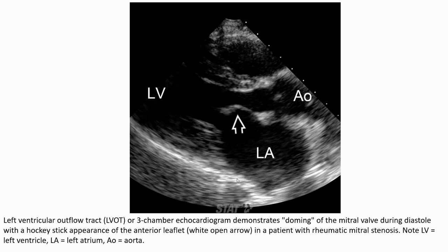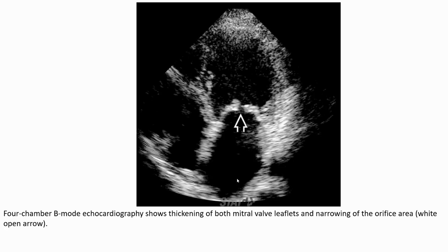This echo image demonstrates doming of the mitral valve during diastole with a hockey stick appearance of the anterior leaflet, in a patient with rheumatic mitral valve stenosis. This other echo image shows thickening of both mitral valve leaflets and narrowing of the orifice area.